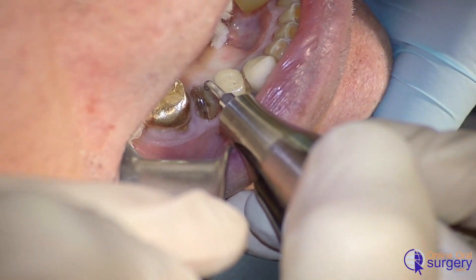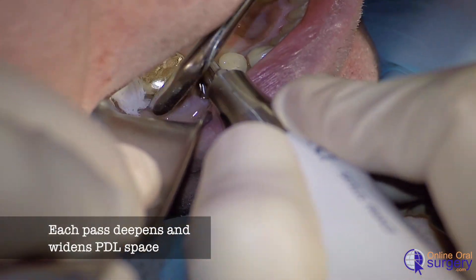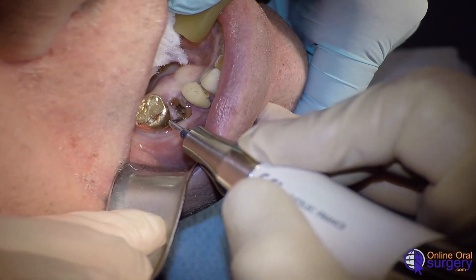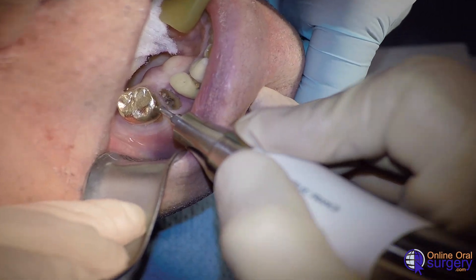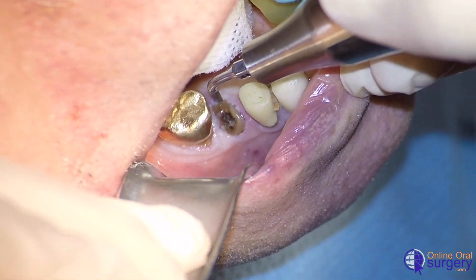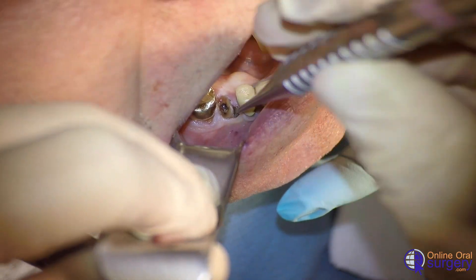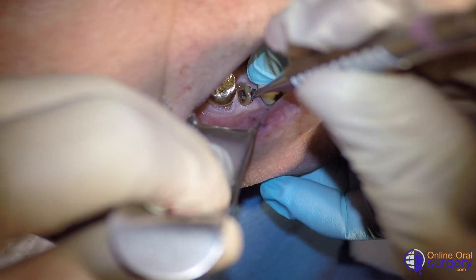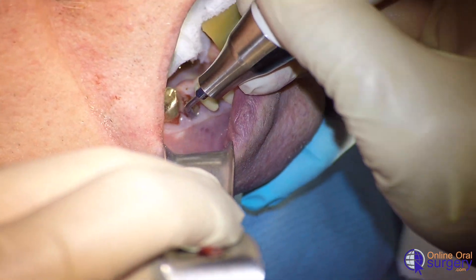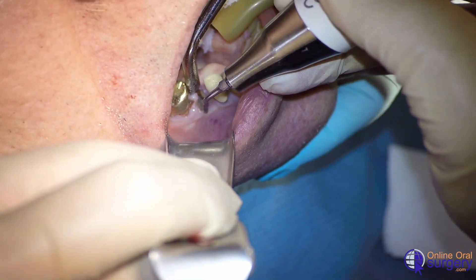If we didn't get much movement, we go back to the piezotome and accentuate our separation of the periodontal ligament space on the mesial aspect again, going deeper and passing in a buccal-lingual direction with the tip — this is also going to widen the periodontal ligament space. We repeat this on the distal aspect, making sure we've gone deeper than previously. Then we take the piezotome tip and do the same on the lingual aspect of the root, starting superficial and then going deeper. Now trying to luxate the root again with the approximator, we're getting just a little bit of early movement. We do the same on the distal aspect down the PDL space, then come back with the piezotome and start superficially on the facial, going deeper with each pass, deepening the separation of the periodontal ligament completely around the root.